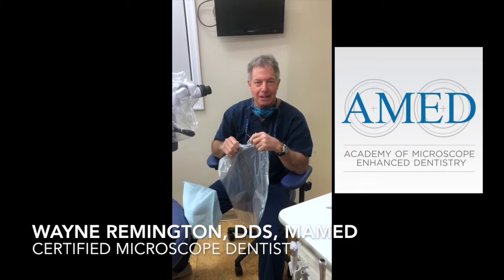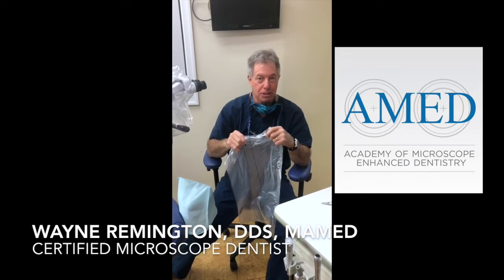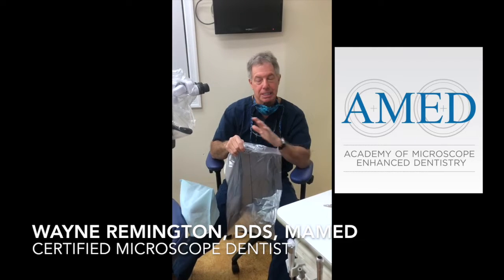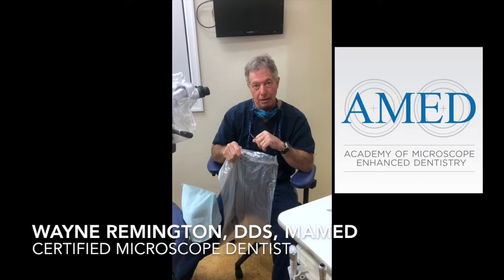Hi, Wayne Remington back again with an additional barrier protection that you can use while using your surgical microscope. This is to protect the operator from spray from patients.